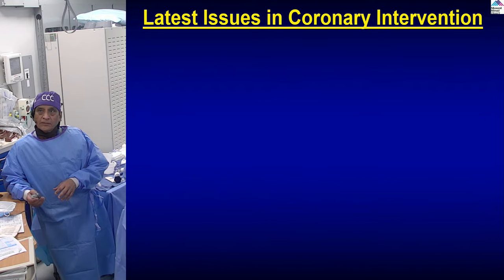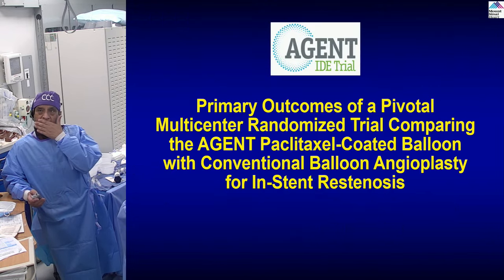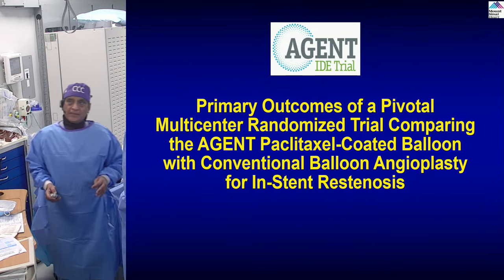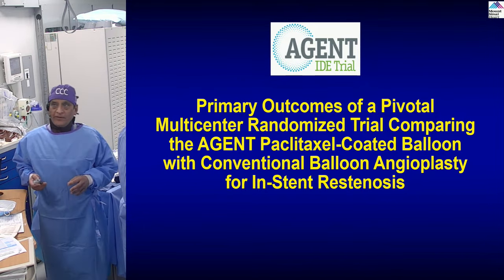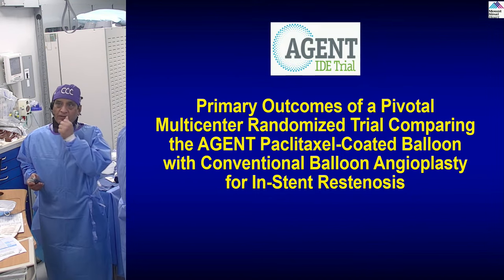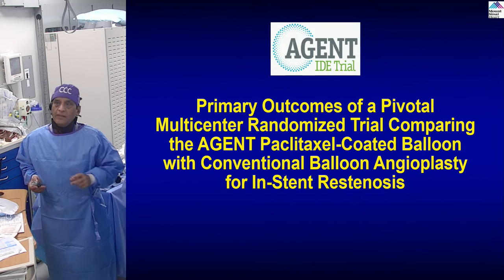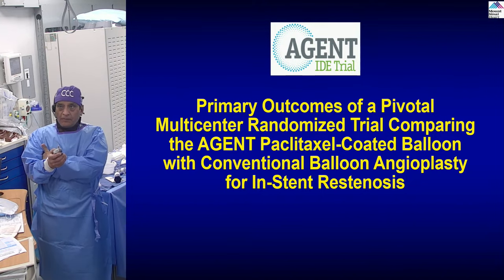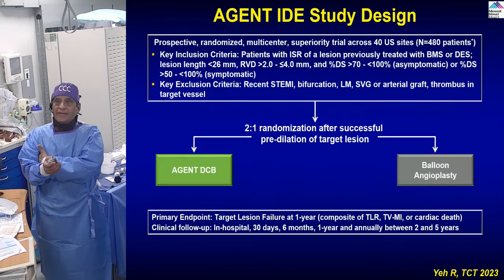So let's go through our trials from TCT. The major coronary trial, the top trial presented, is Agent IDE. We had been waiting quite a bit for this Boston Scientific trial of the paclitaxel-coated balloon, Agent, compared to conventional balloon angioplasty for ISR.